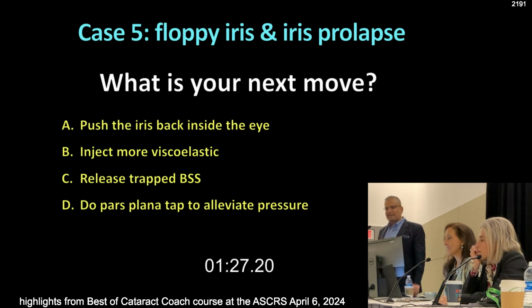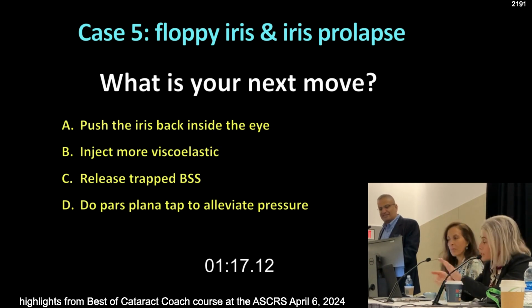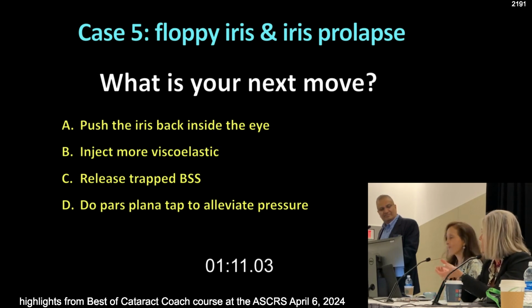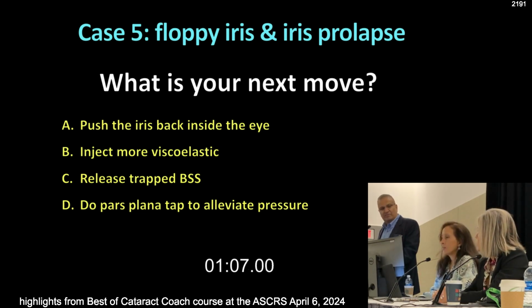Push the iris back. More viscoelastic. Release trapped BSS. Do a pars plana tap. What are you going to do here, panel? Release your trapped BSS, by doing what? You were saying blot the lens down. Let the fluid come up and over, because you've got too much posterior pressure. You've talked about this. There's too much posterior pressure, and that's what's pushing the iris. So what did I do wrong? Too much BSS? Yep.